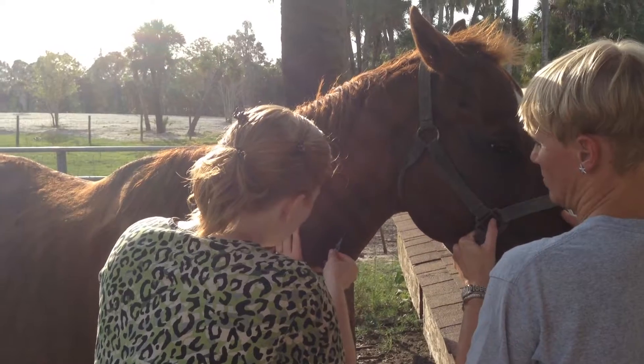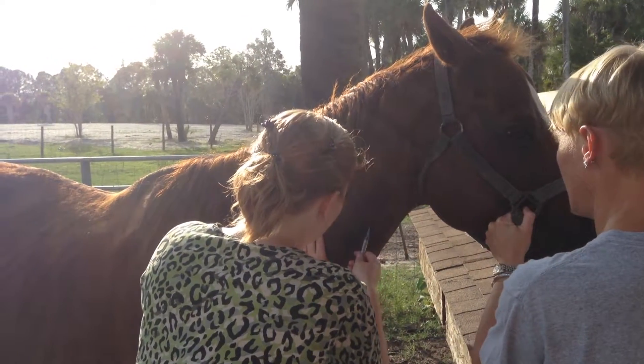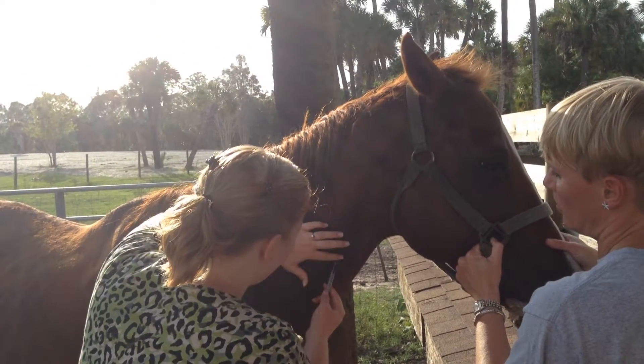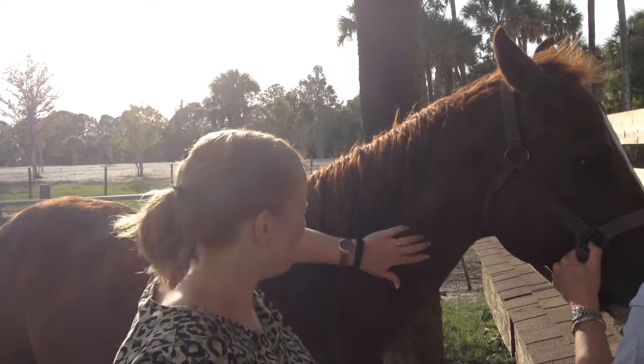I'll insert my needle and then apply negative pressure to get my sample. Okay, that's video one.